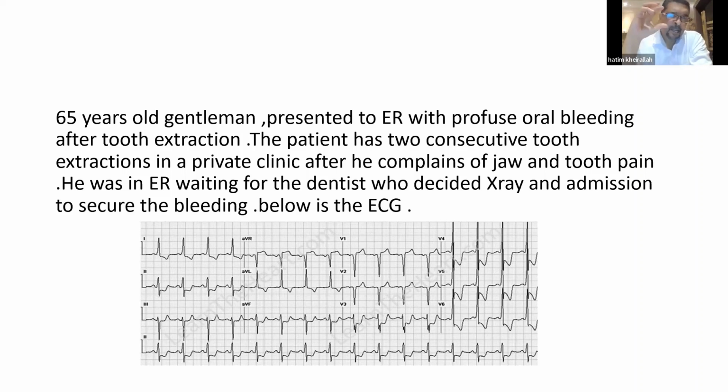Right. I brought this question just to stress the fact that ischemic chest pain can be so atypical. This is a real patient of mine, and I was in ER that day. One of my colleagues approached me and showed me this ECG just to comment on it, and he said this ECG is so gloomy. So can I see the patient? I went bedside, saw the patient and interviewed him. And then I changed the entire diagnosis.